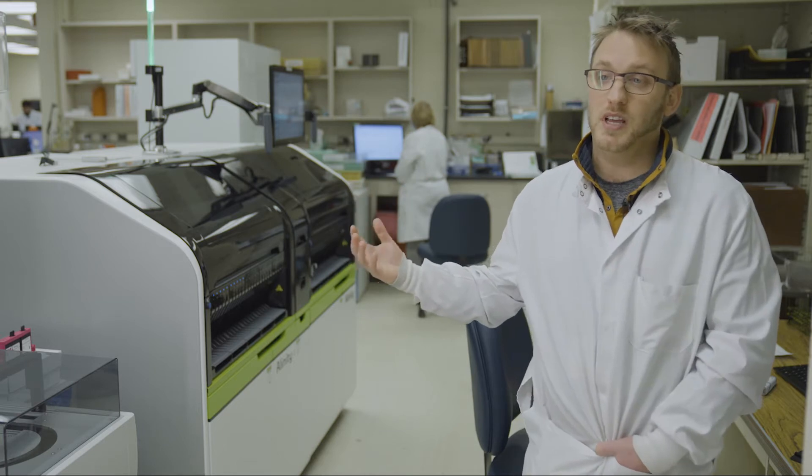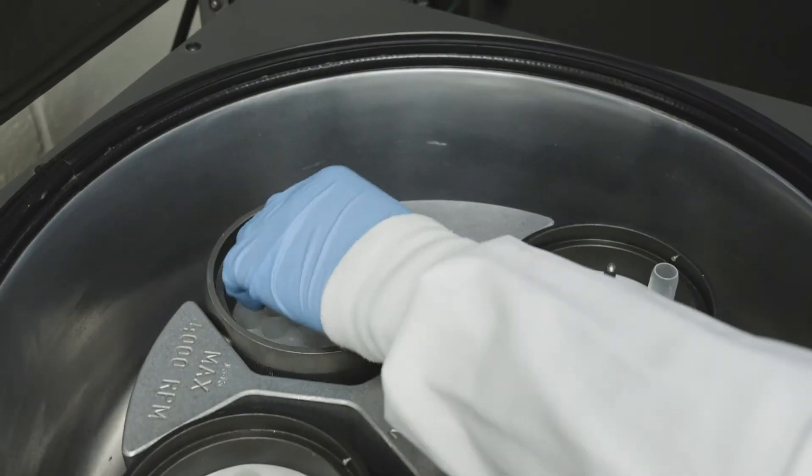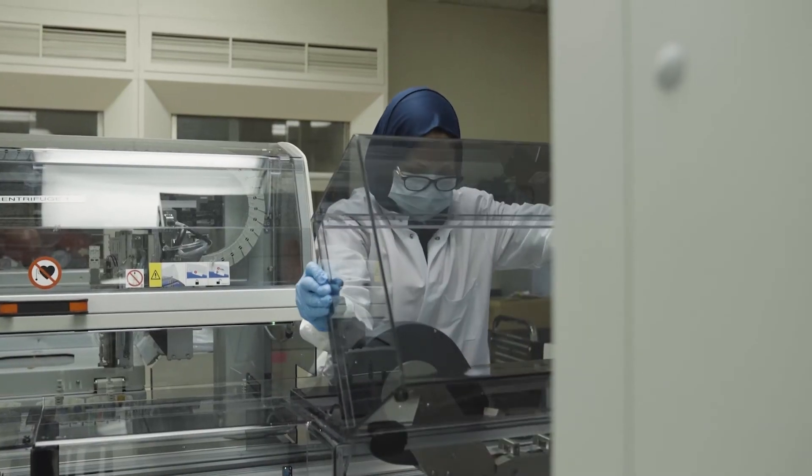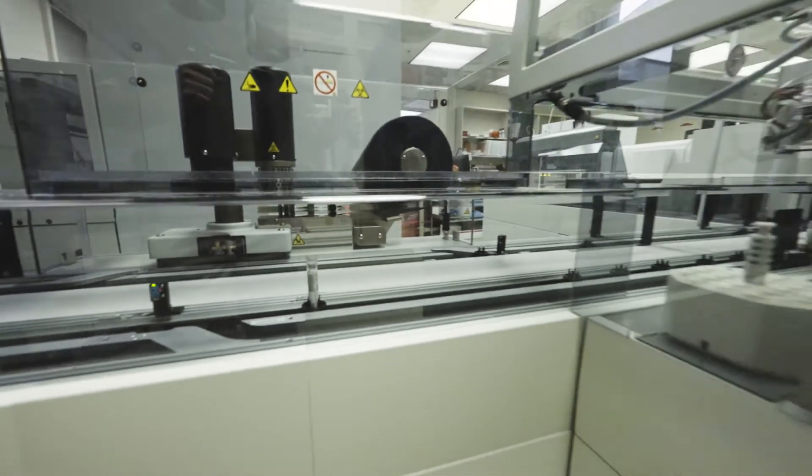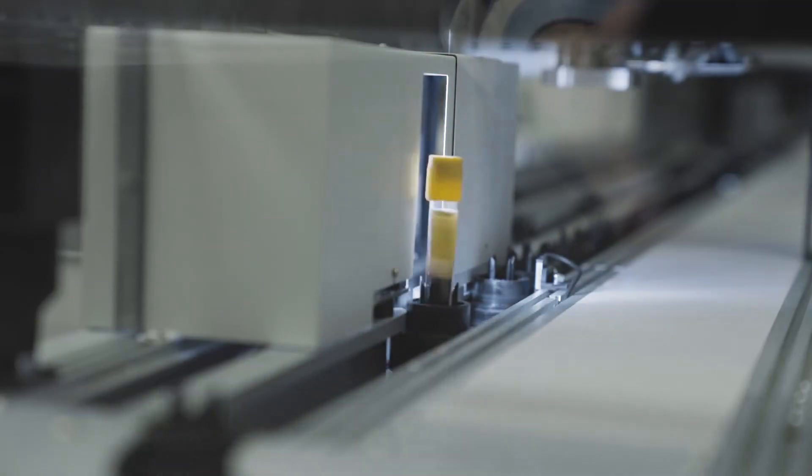When doctors order something stat, they want to know that they're getting something as fast as they can and this track does do that now. The way it's laid out, it can move a specimen on the track to prioritize it to get ahead of routine testing.